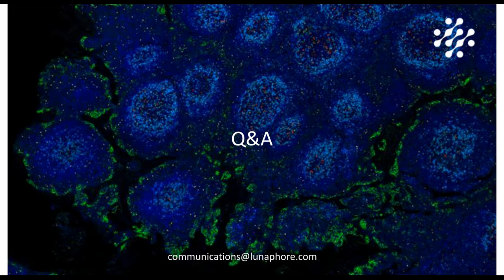So there's a transition to make from single marker optimization to the multiplex optimization. So basically what you want to make sure is that you do not perform differently when you're in the multi-marker staining compared to the single marker staining. So it is very important to make sure that your SBR hasn't changed, that you do not have bleed through from other markers in your single marker channels.